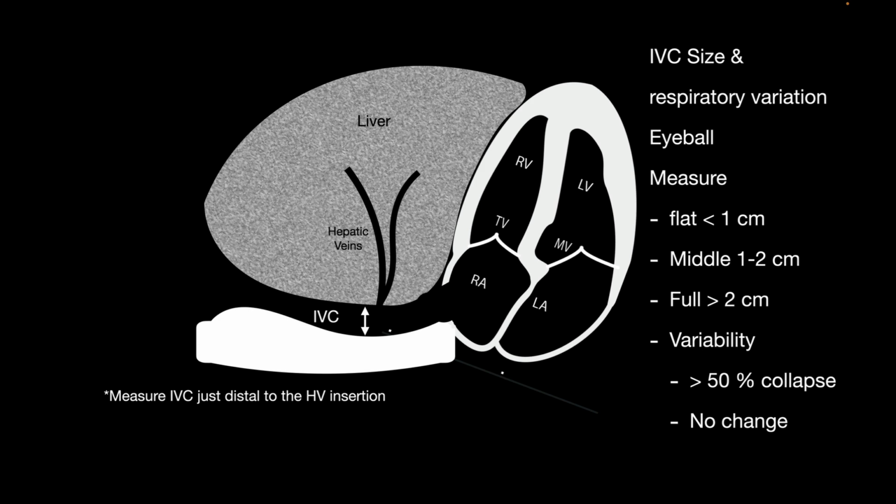All right, so that's the basic sonographic anatomy. You need to do this regularly. You need to practice hands-on if you want to get good at this, and it can be quite frustrating when you're learning, but get the patient into good positions, roll them onto their left side. Don't forget that you may not be able to get all the windows in every patient, so you need to be able to move on and keep looking through the different windows until you get all the information that you need.